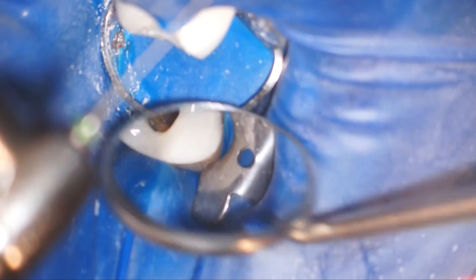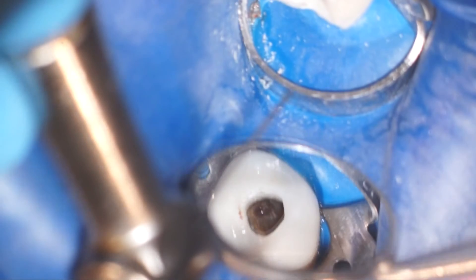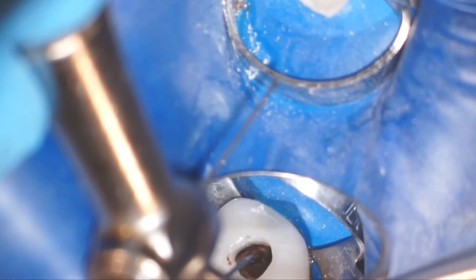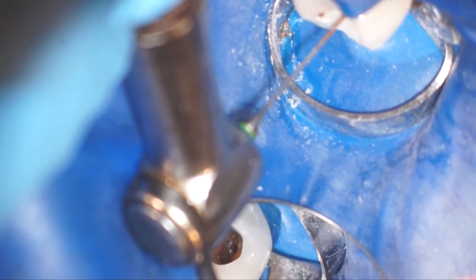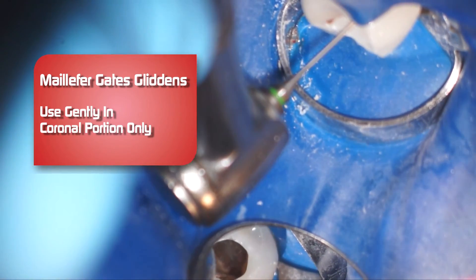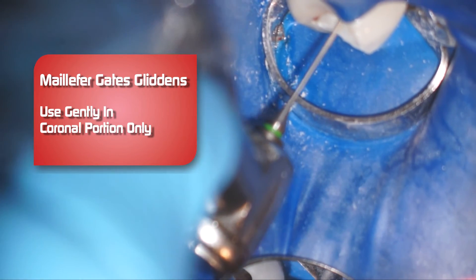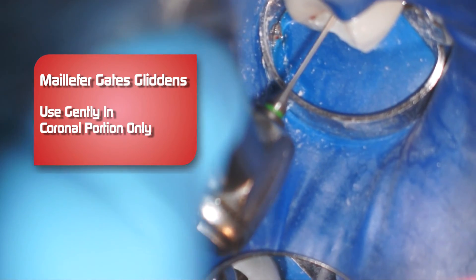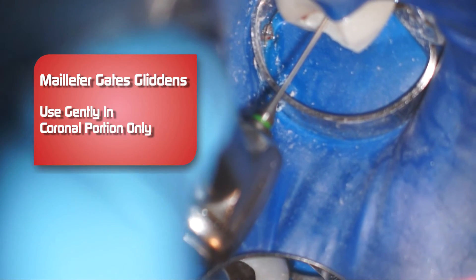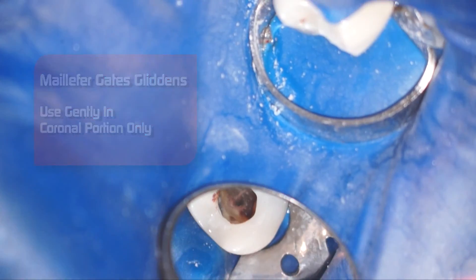Now we're going to introduce the Gates Glidden burr, but as opposed to the previous case, this one we're going to stay much more coronal because the canals are tighter and much more dilacerated. So we're going to start out with a number two in the palatal canal, distal buccal, mesial buccal. No pushing at all — just very gently, like a paintbrush, and you can see that Gates Glidden flexing. It's a number two, so it's much more flexible than the larger sizes.